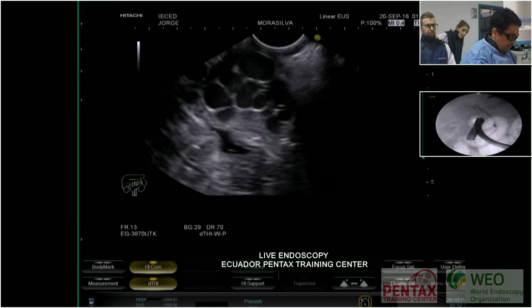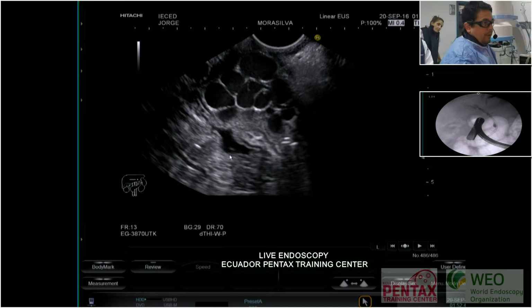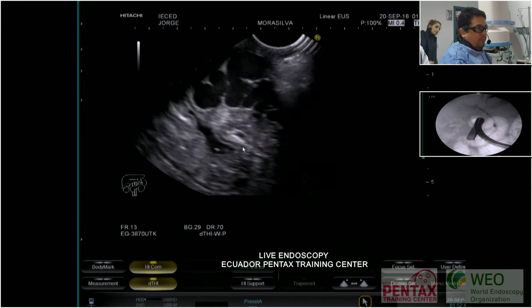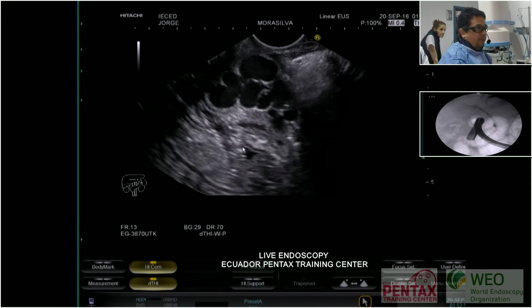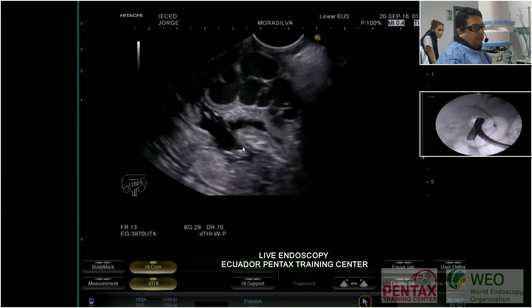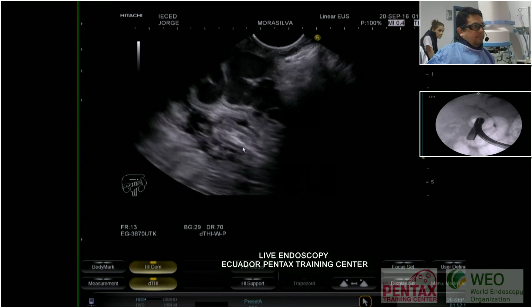So here, I will explain: this is the gastric varices, this is the stomach wall, and this is the gastric fundic area, okay? When you put water, you can separate the walls and you can see very well if you are in the correct area.